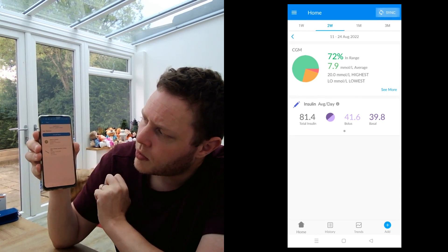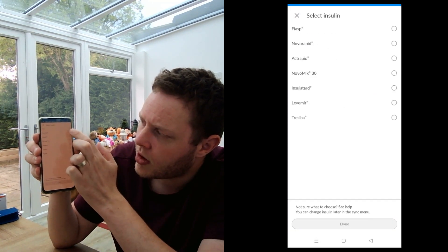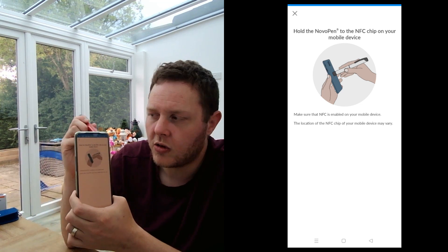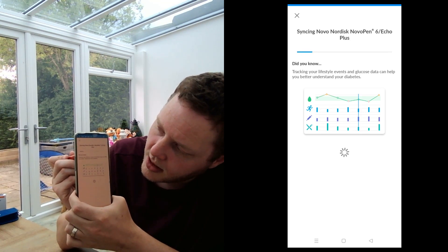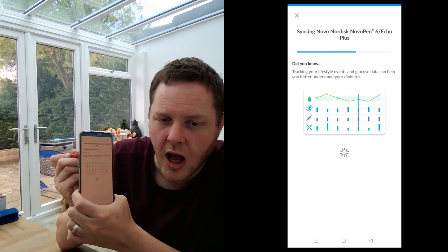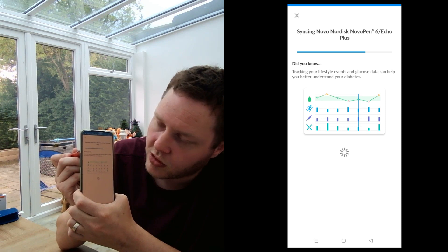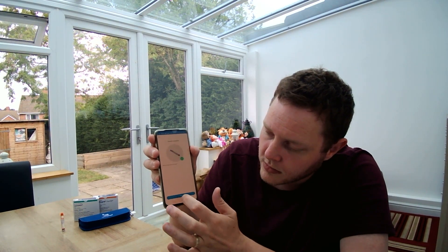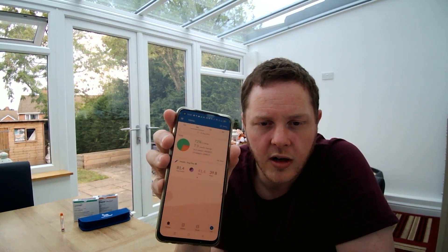I'm going to show you how to upload your data from your pens. Click on the sync button from the home tab, click on Pens, press Next — I'm going to use the Novorapid pen. Then on the back of your phone where the NFC chip is, use your smart pen in memory mode and simply tap it onto the back, and it will synchronize all the data from your smart pen onto the app. Once done, it will confirm it's been successfully uploaded. Press Done, proceed through the pages, and it updates the relevant information on the home screen.